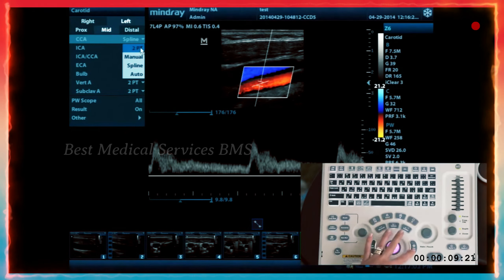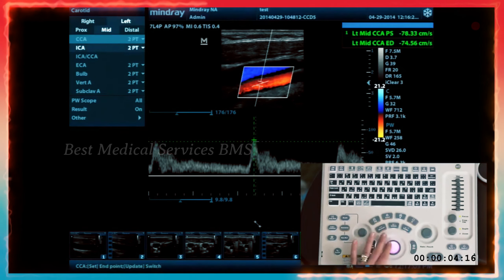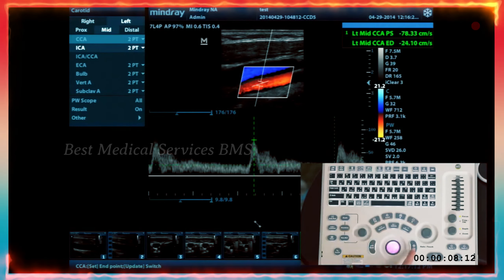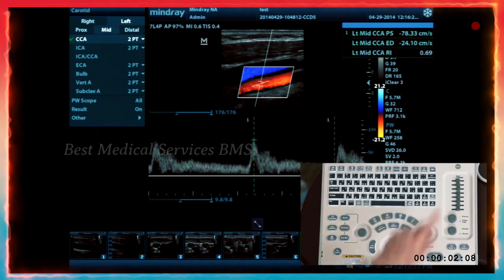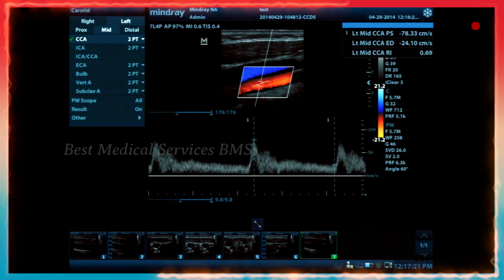Let's go to two-point measurement, which is the most basic and the default. Using the trackball and the set key, you've placed your measurement calipers at the peak systole and end diastole, and use the set key to move both. You'll get your measurement results shown in the top right of the screen.